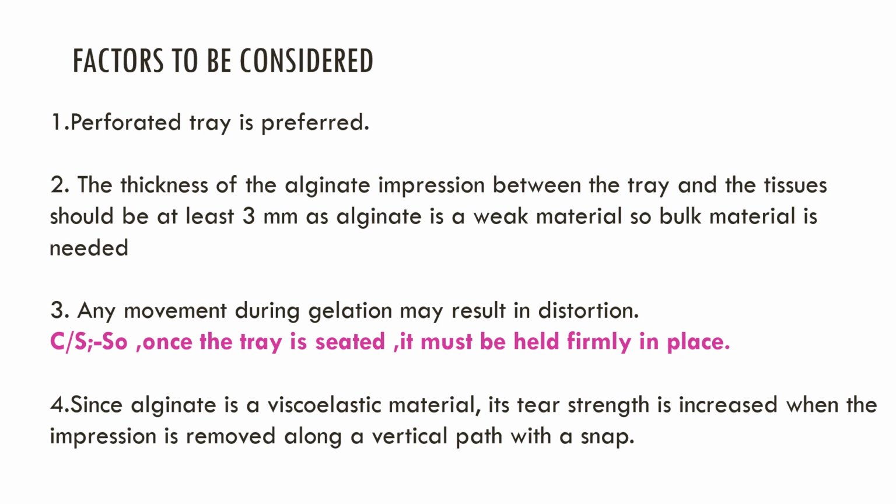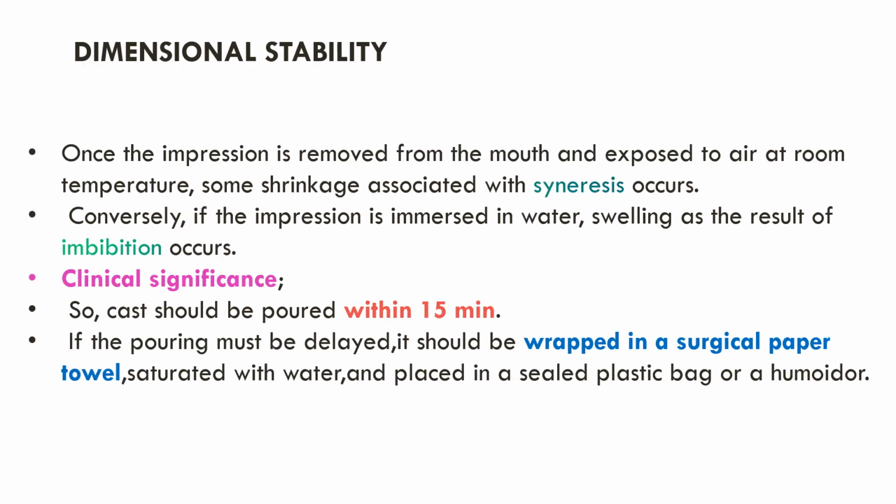Any movement during the gelation may result in distortion of the impression. Dimensional stability has to be kept in mind because it may result in syneresis or imbibition. If there is more imbibition, water may get incorporated into the impression and it may swell up. So cotton wrapped and properly squeezed should be kept in.